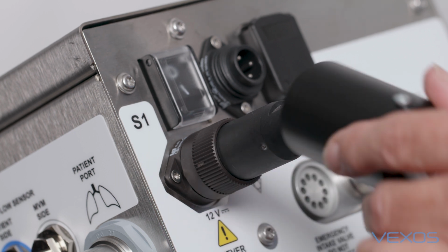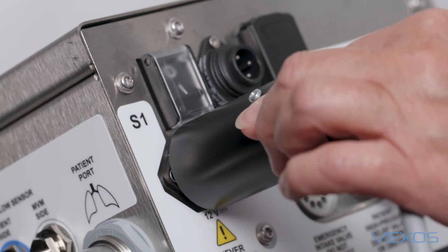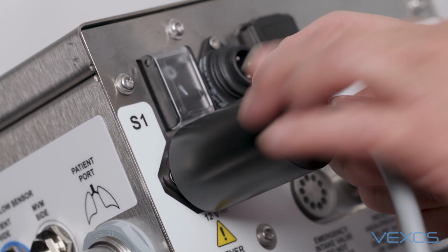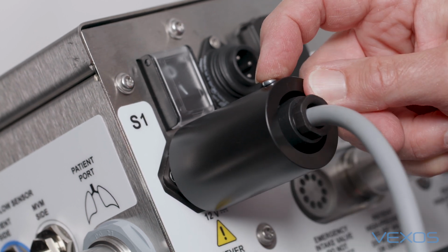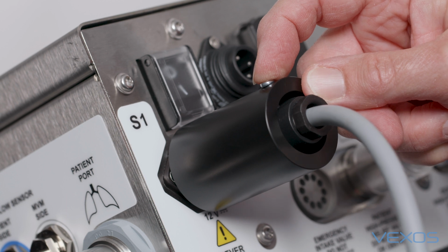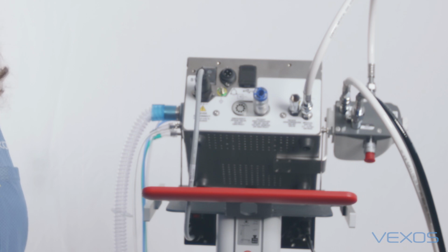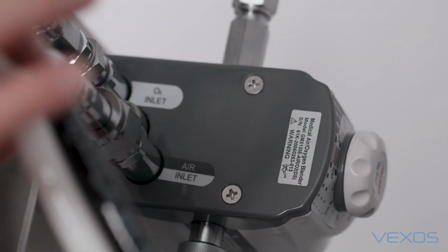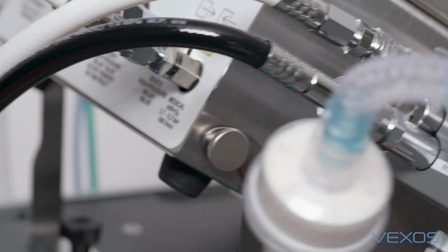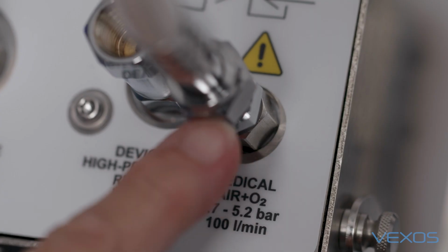To further create a safe environment so that this cord can never be removed from the unit, a sleeve can fit over here and be adjusted and secured with this screw. The MVM does not have an internal battery, therefore it's vital that this is never disconnected so that there would be battery backup in the event of an electrical failure. This is the blender. These are the gas sources that come from the hospital institutional source. The blended gas then comes out and enters the ventilator here.